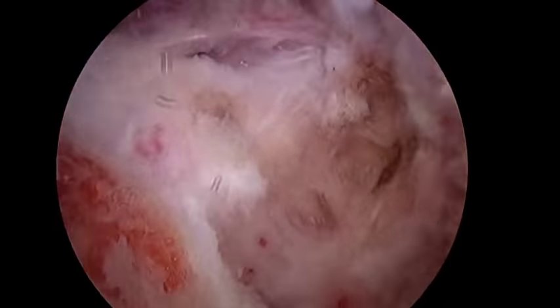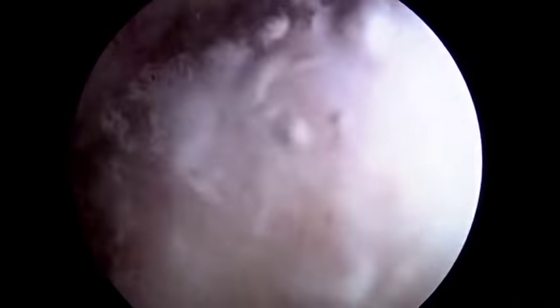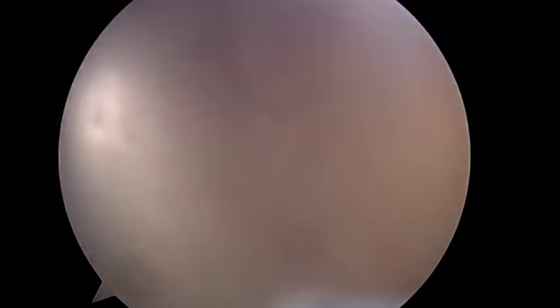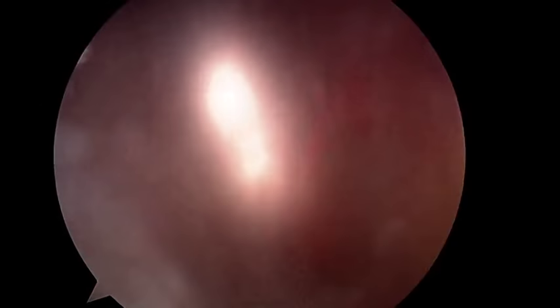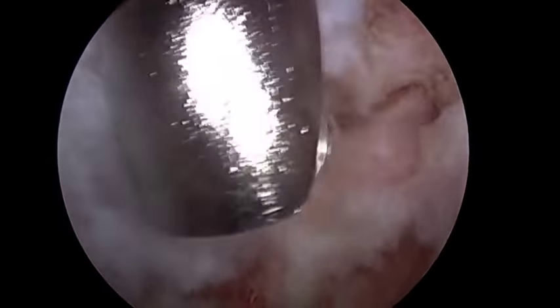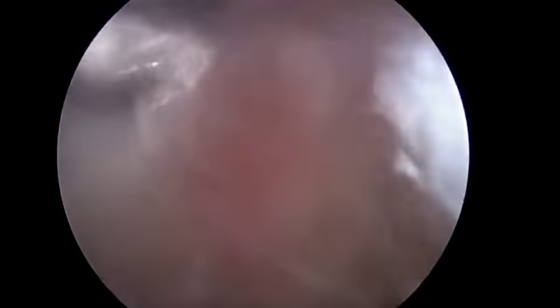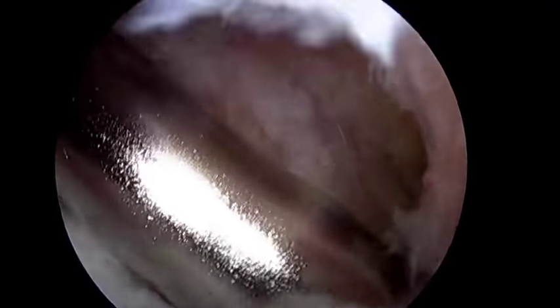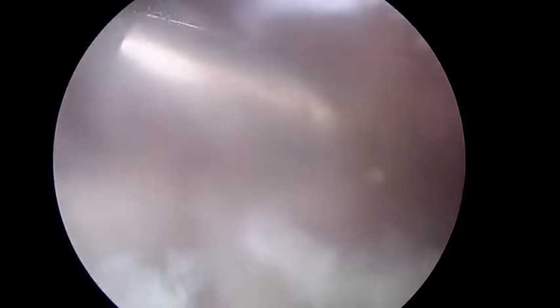I'll take the burr back. And then we're going to smooth off her clavicle. We still have a little work to do up top. Now we're just identifying the AC joint and the end of the distal clavicle. So there's the end of the bone, and we've resected a portion of this before. And we're just going to, again, make sure this is not going to be a source of pain post-op.